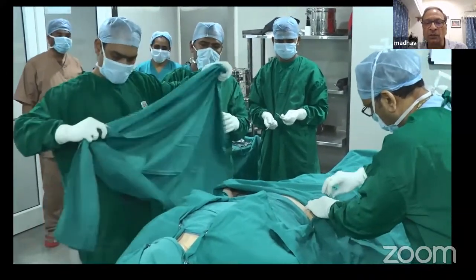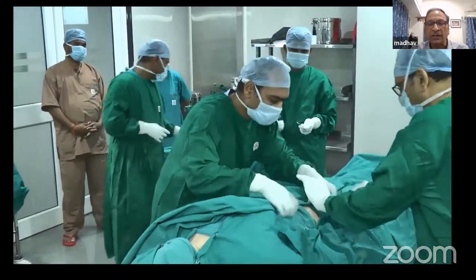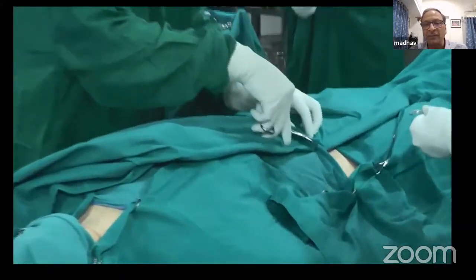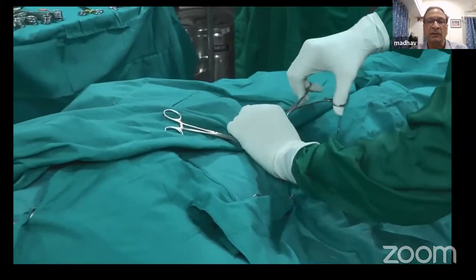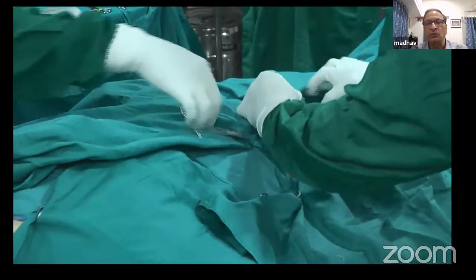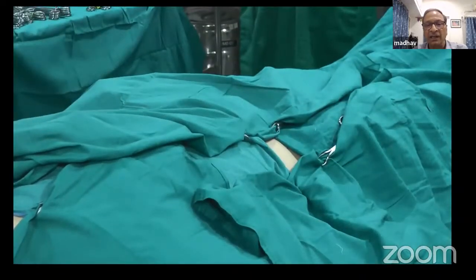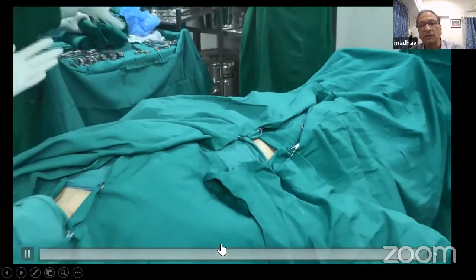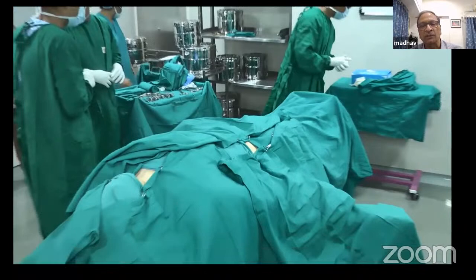What is not shown in the video is before you start draping, you put a sandbag underneath the side of the buttock from which iliac crest you are going to take the graft, so that you elevate that side and make the iliac crest prominent. So as you can see, all these incisions would do better because there are just 4 sheets coming from 4 sides, leaving that operating field area open.